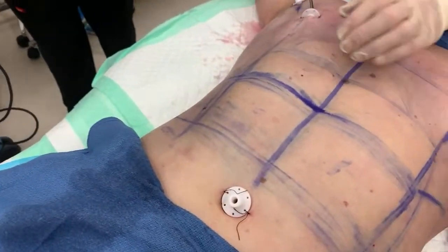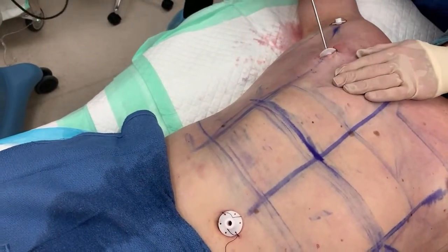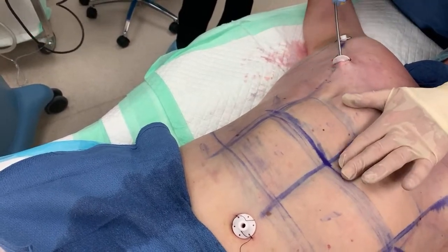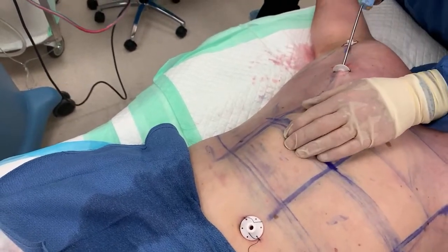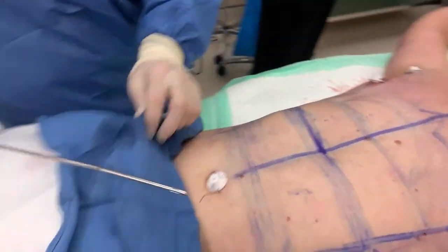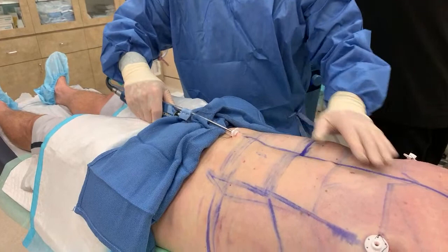Now I do my little karate chop — right there, right there. And my little karate chop. Slip and slide — looks good. I just learned something: I'm not needing to feed this as much because it melts it. So I'm going to go over here and go phasing it.